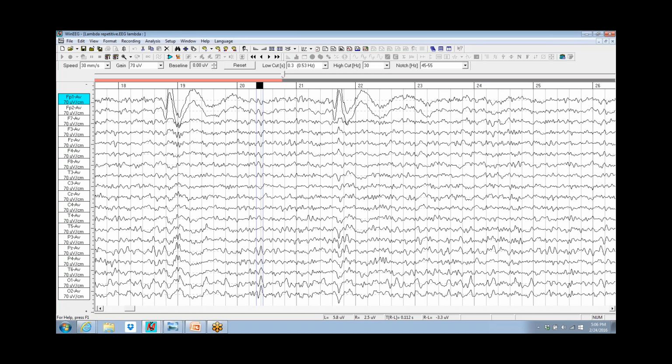You might have a 50 to 100 microvolt rhythm going, and a 5 or 10 microvolt signal as the response to a stimulus, and they just get averaged in and you don't see them.